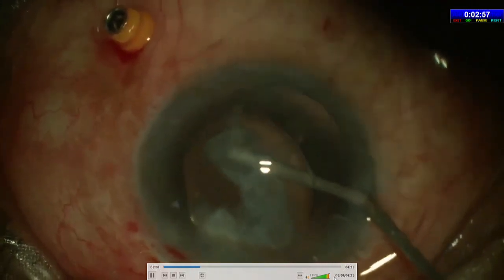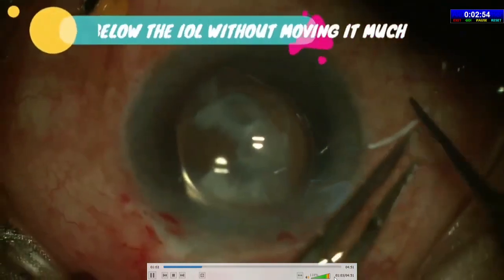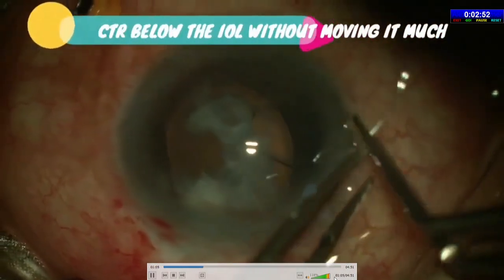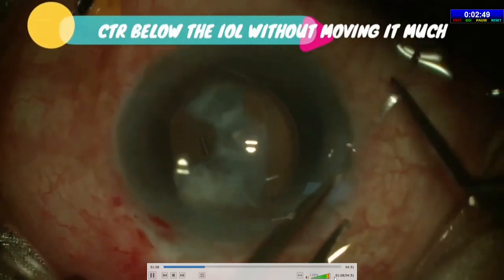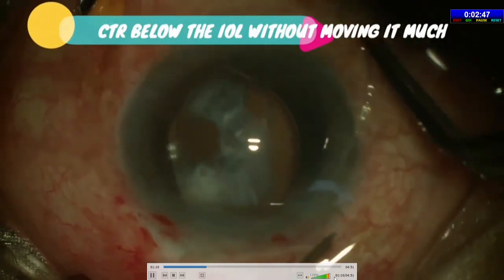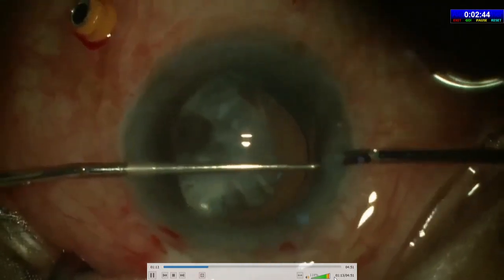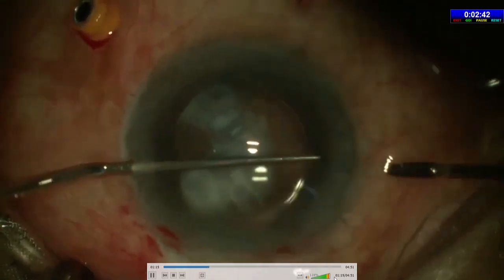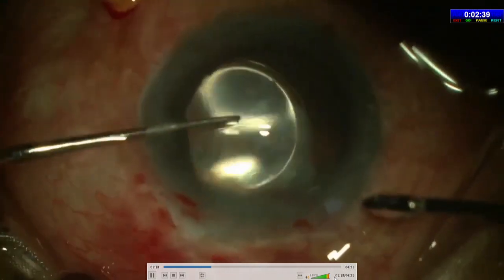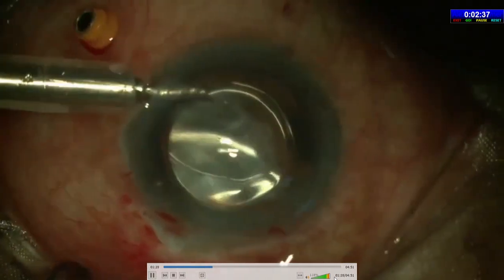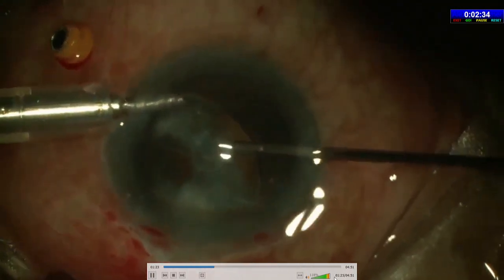I realized I could actually achieve normalcy by inflating the bag and repositioning the IOL inside it, rather than explanting it or leaving it in the sulcus — for sooner or later it would decenter and get dislocated through the zonules. The challenge was to open out the bag without disturbing the IOL much. Gently lifting the IOL and inflating the bag with viscoelastic, I managed to insert a capsular tension ring from under the IOL using intravitreal forceps to maneuver the CTR back.